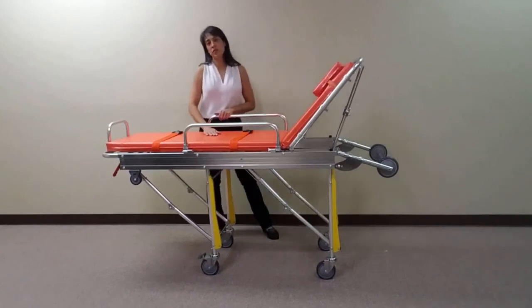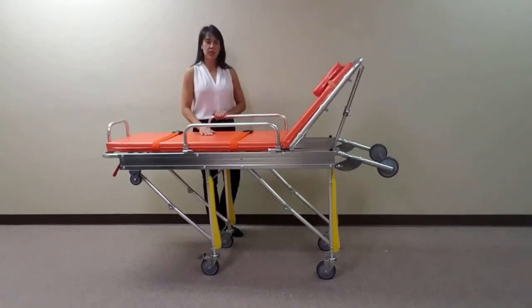This unit only needs one person for loading and unloading in a transportation vehicle. The MS-3C-153B is made of aluminum alloy and has a weight capacity of 350 pounds. This stretcher comes standard with a one-year limited warranty.